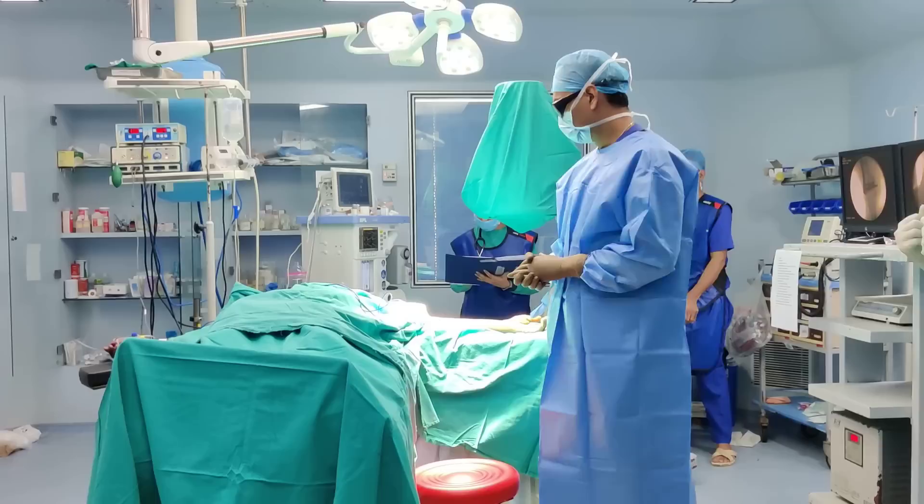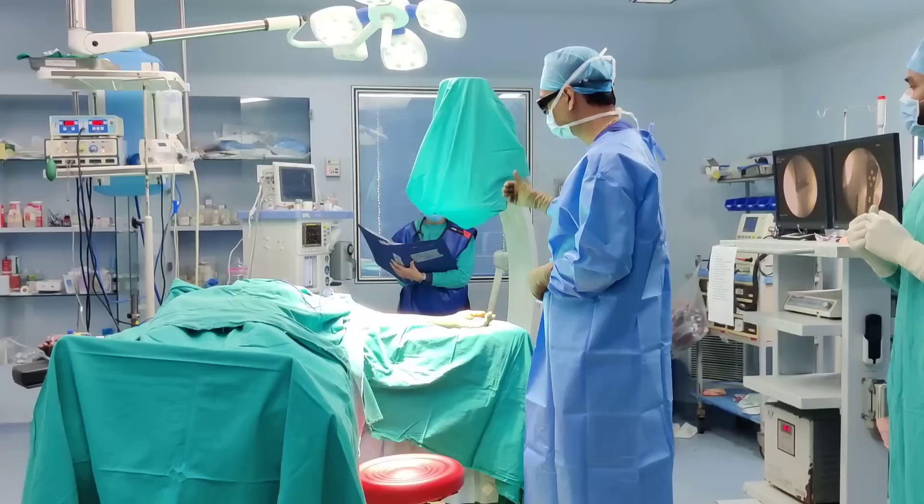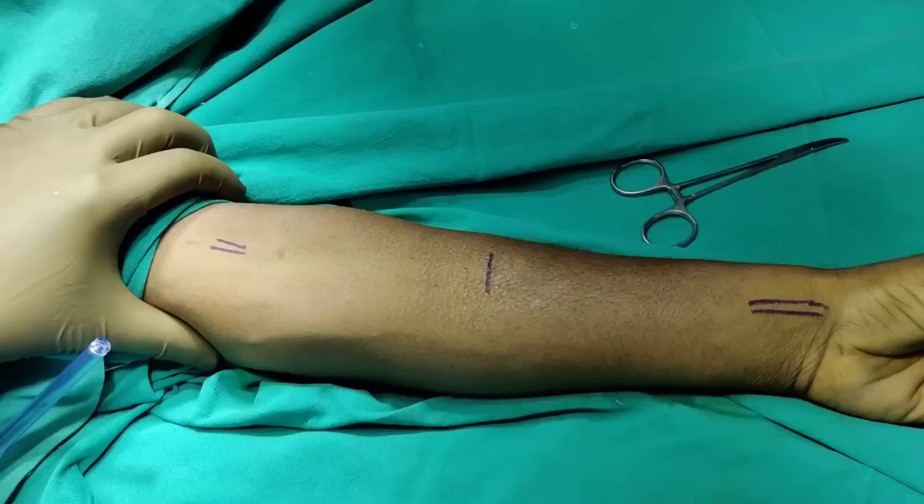This is our setup. The patient is supine and we are going to use a tourniquet. The hand is on the hand table because it is the left hand. I am going to sit on this side. The C-arm is going to come on the top, my image screen will be on my left side, and the trolley will be here.